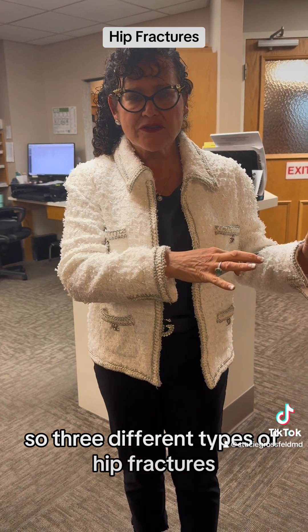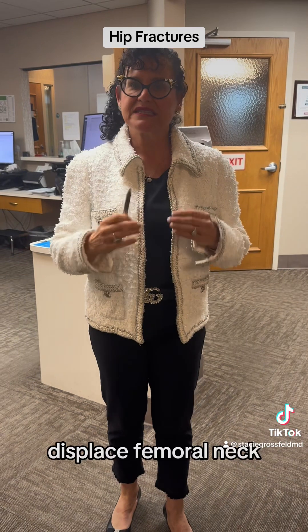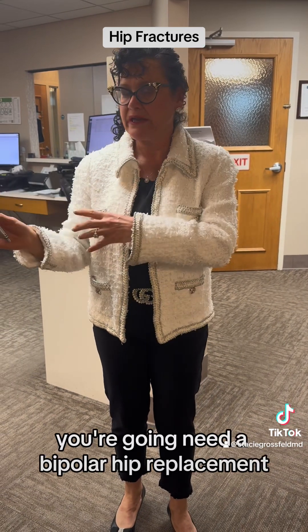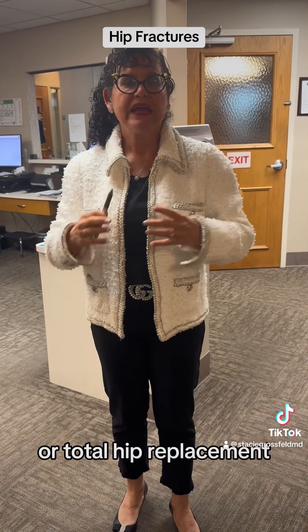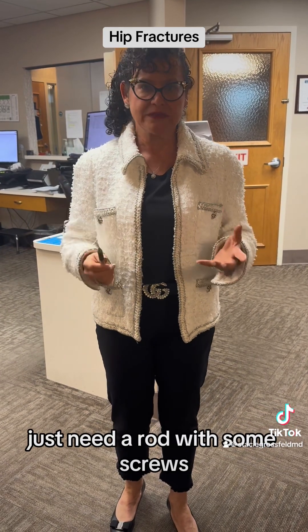So, three different types of hip fractures: a non-displaced femoral neck fracture is treated with percutaneous pinning; a displaced femoral neck fracture requires a bipolar or total hip replacement; and an intertrochanteric fracture just needs a rod with some screws.